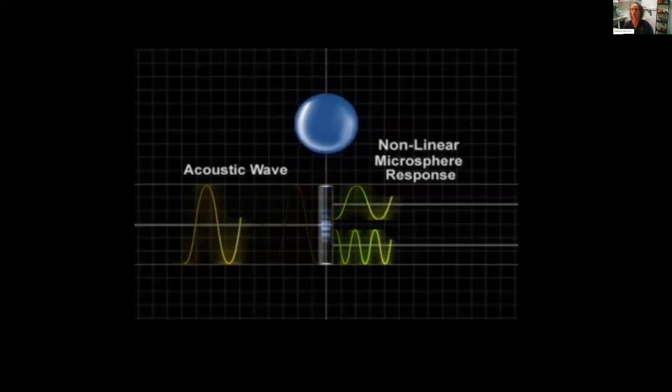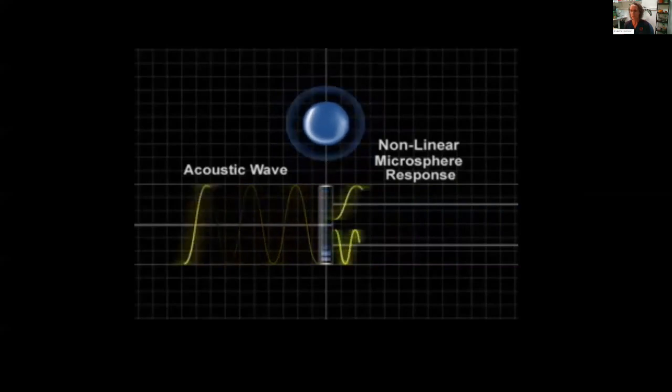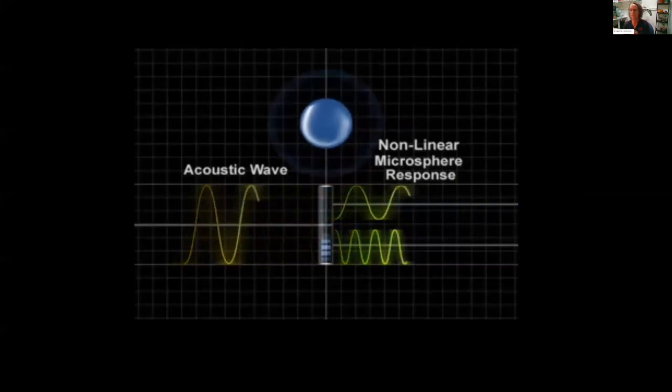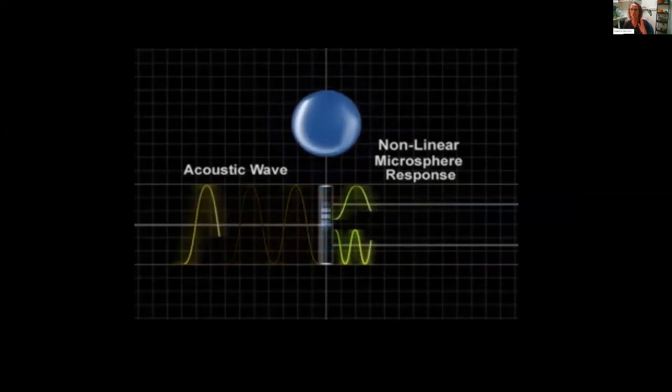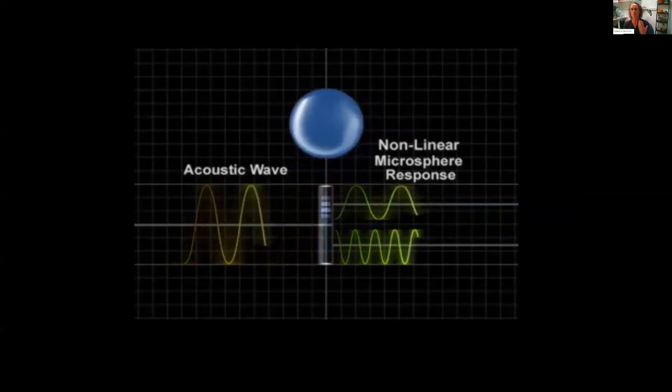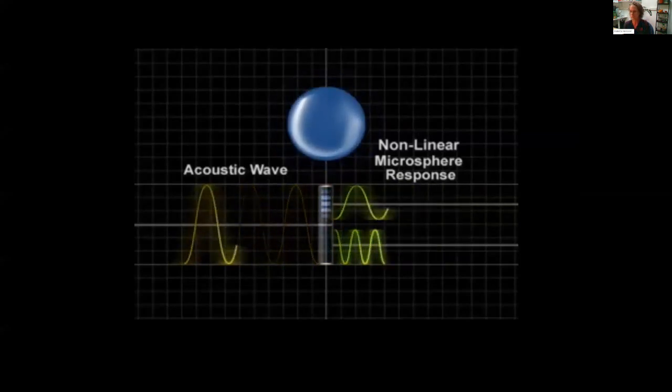Now, contrast imaging techniques are trying to detect the echo coming from the microbubble while at the same time suppressing the echo coming from the tissue. So that's why the tissue always looks so very black, because these techniques are actively trying to suppress the signals coming from the myocardium.